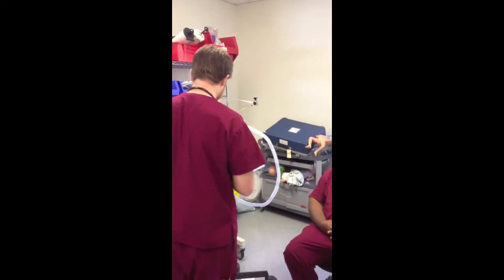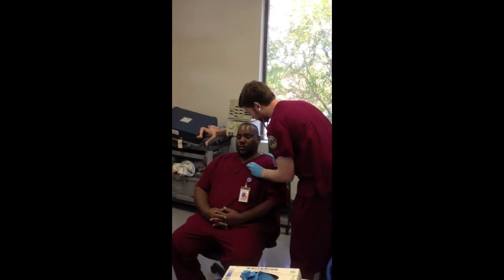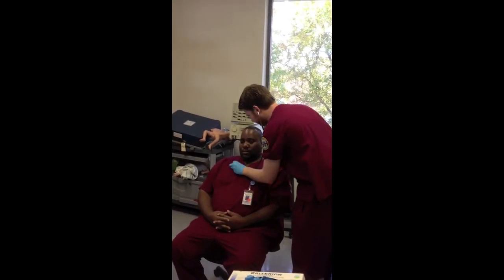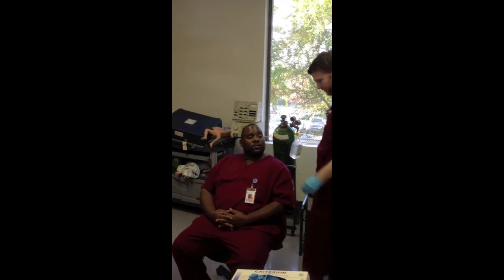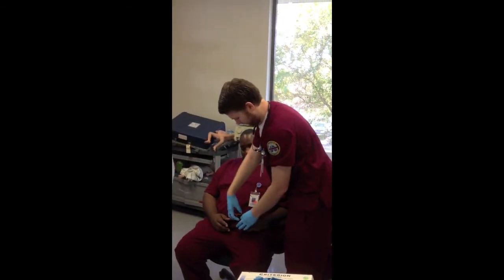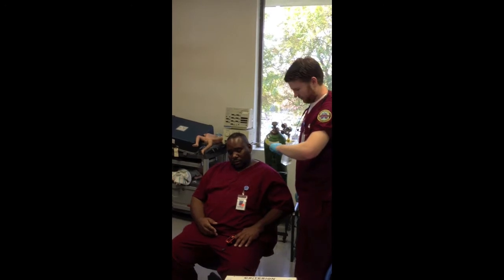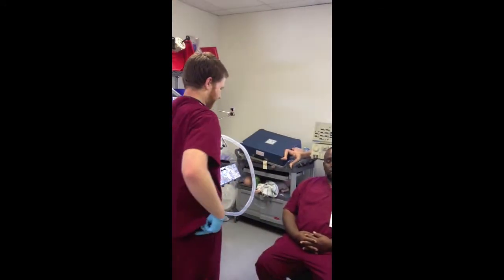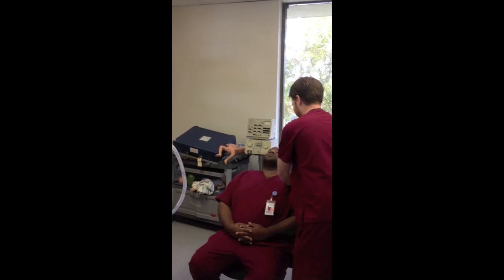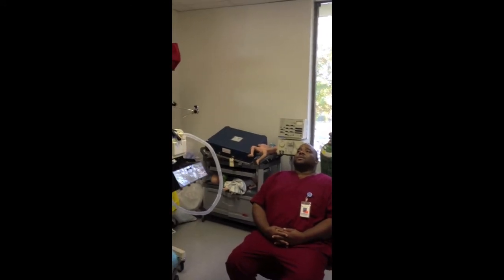Now, do a patient assessment. The patient now should be placed in a semi-Fowler position. Step 8 is to prepare the patient by auscultating the chest and, if needed, suction the patient first.